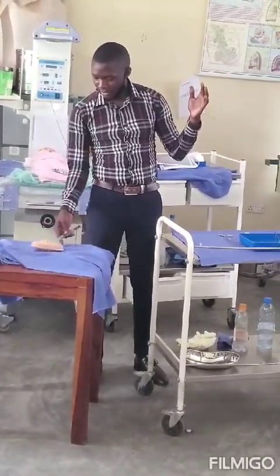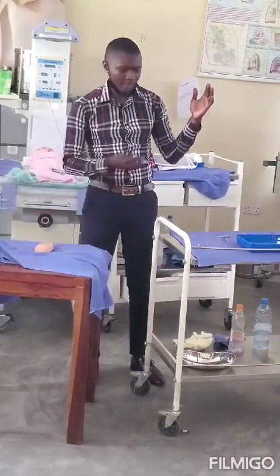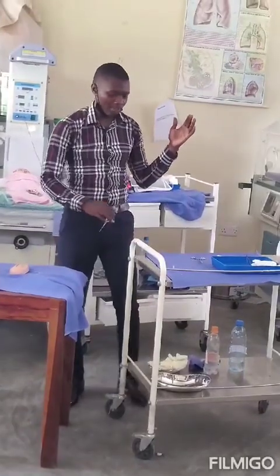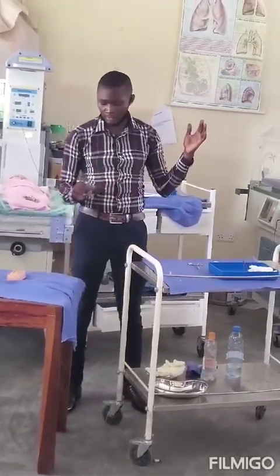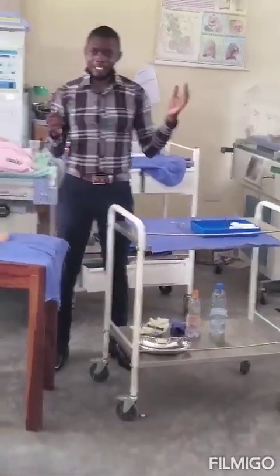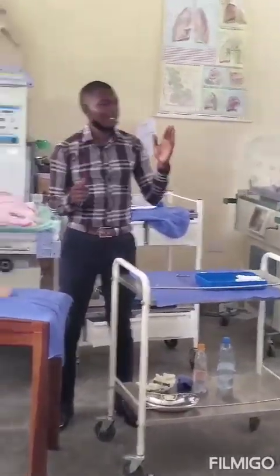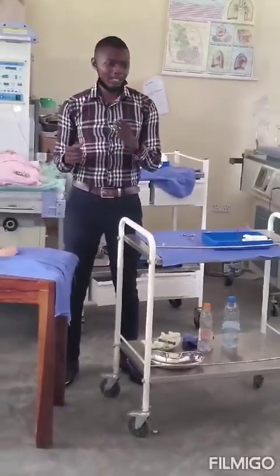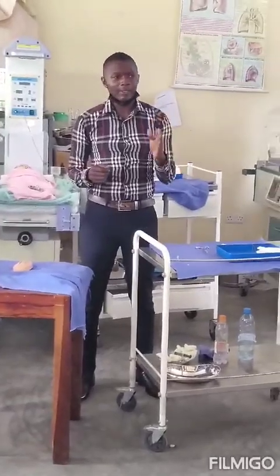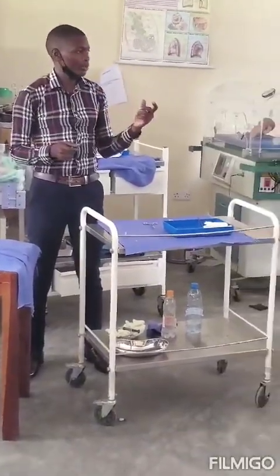So once you give everything, this will go straight into the sharps box, which will be tied just somewhere here. So you drop it into the sharps box. For now, I'll throw it there. I said it's a wound care injection giving, the knee suturing. So at this point, I've cleaned my wound. I've given the lignocaine, meaning I'm now ready to suture.